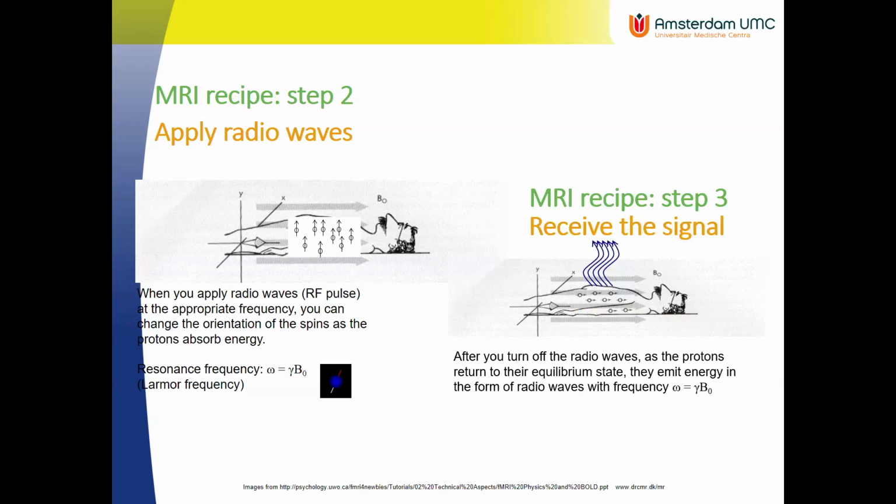Okay, and then obviously we're going to receive that signal with an antenna, a very sensitive antenna. The energy we put in, the power of the radio wave that we do the excitation with, is way stronger than the signal that comes out of the body. That's a very weak signal, so we have to listen very carefully after we blast all the energy in.